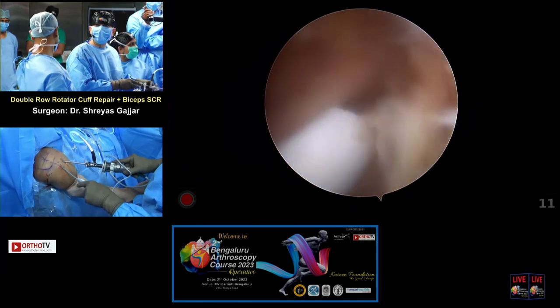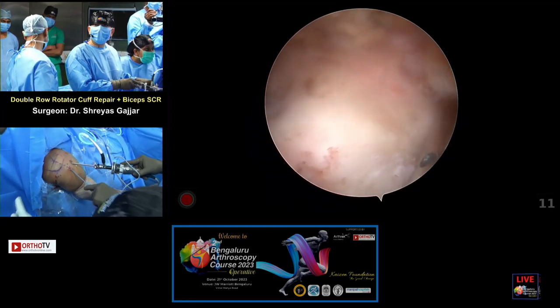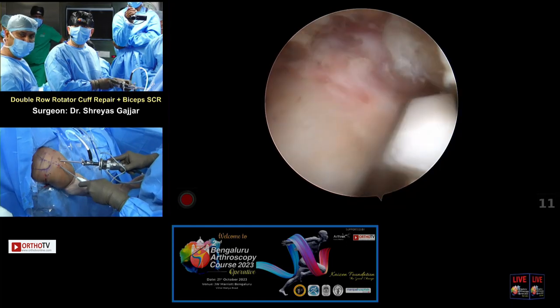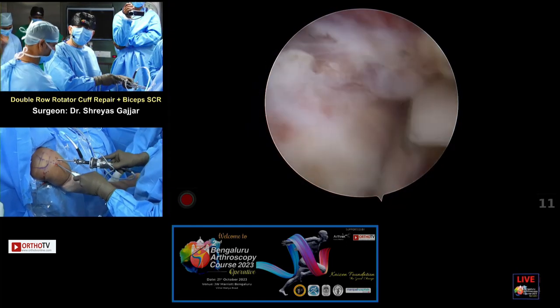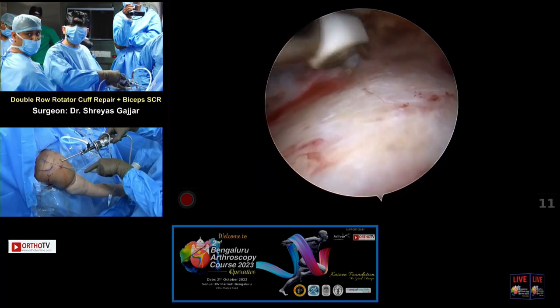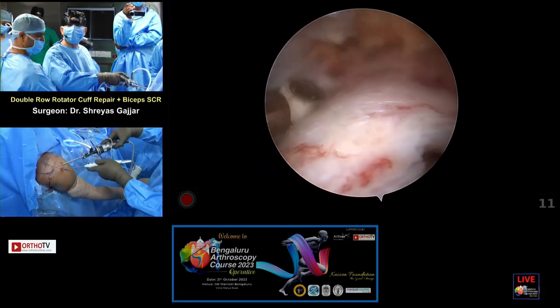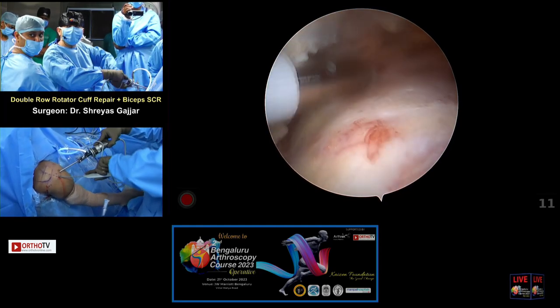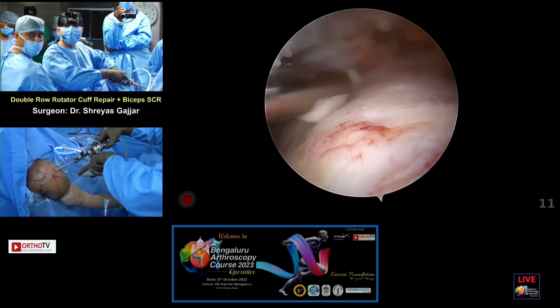But do you recommend the passport cannula over here? Anything. I use the triple dam, but passport is also good. And I'll again tell you why I use the triple dam. I'll demonstrate the reason for it. But what you need is a clear cannula, so you can see your sutures as you pass it through the cuff, as you tie it. You just need a transparent cannula rather than an opaque one.